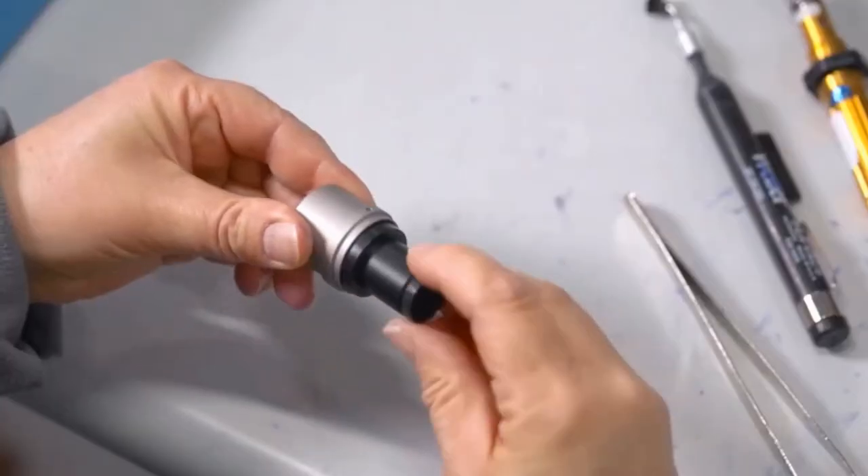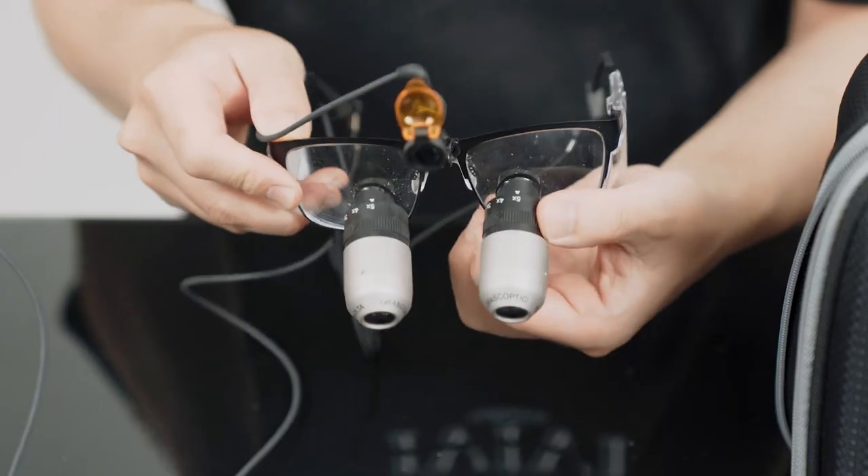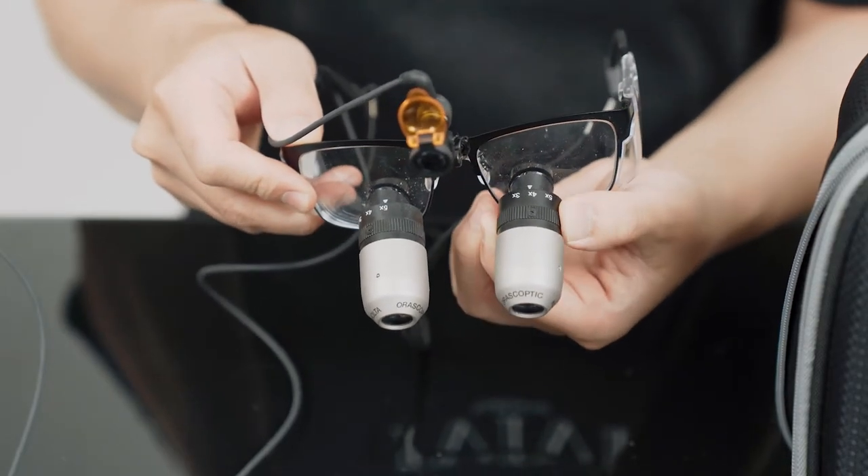The build quality is excellent and the optics are crystal clear, which is something you'd expect from a brand like OroScopic. It's very simple to switch between the different magnifications by turning the dial until you feel a click. Something to note is that you have to choose either three, four, or five times magnification — you can't select anything in between.